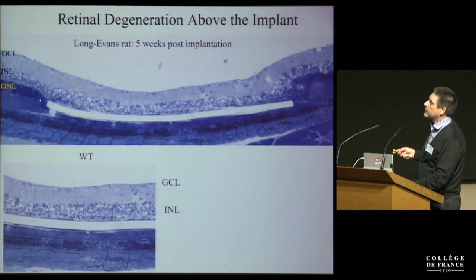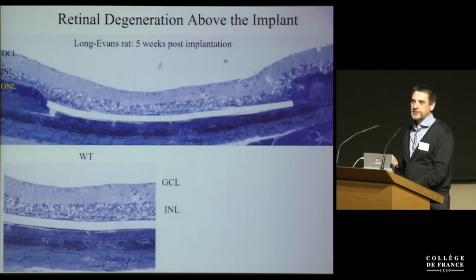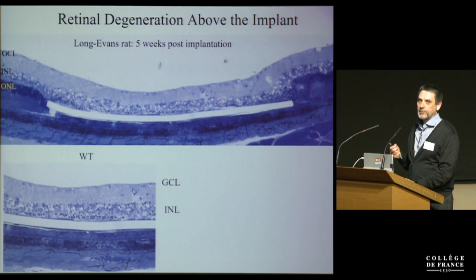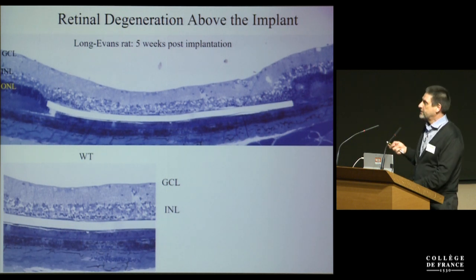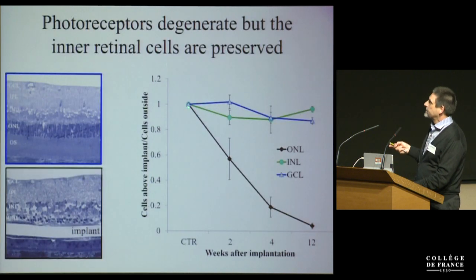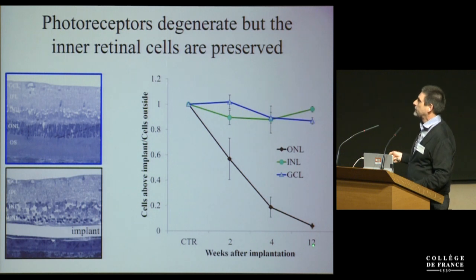This is normal retina. After subretinal implantation, photoreceptors disappear over a few weeks because they're separated from the RPE. And we create this local retinal degeneration, which allows us to study the interaction between normal and prosthetic vision. That's a very important feature, that in the same animal we can study response to normal vision and prosthetic stimulation and compare them. This local degeneration shown here is very similar to degeneration in RCS rats. You see preservation of inner retina on RPE, and photoreceptors are practically gone. This degeneration of photoreceptors occurs in a matter of about 3 months, while the inner retina is preserved.